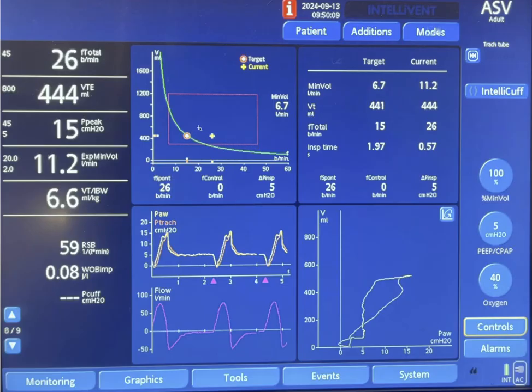And then you see what's happening for the patient. As you see you have the cross sign here or the plus sign and this is what the patient is actually doing right now. So he's at target in terms of the tidal volume but his respiratory rate is high.